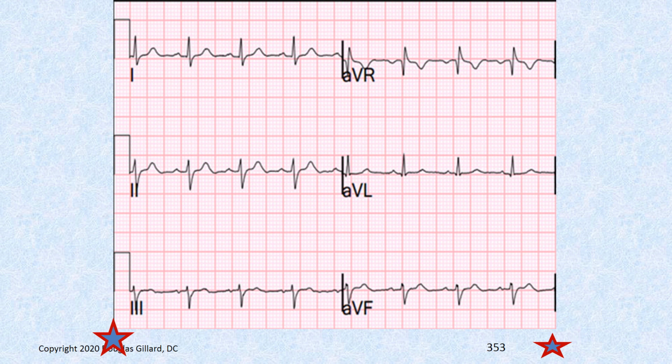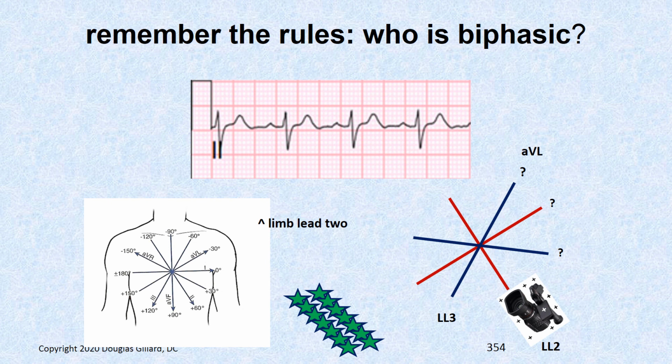All right, so I think it's nice and easy to take limb lead 2. So that's our most biphasic. So we're going to look through the eyes of limb lead 2 to determine this. Okay, limb lead 2 is biphasic. Next, we need to know which direction things are traveling. I worked really hard to make some new ones, but I didn't go back further, so I've got some better ones coming. This is a little bit older. But let's figure it out.